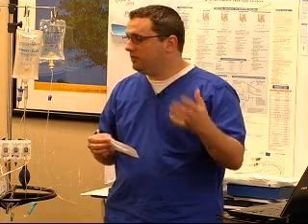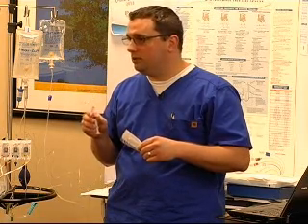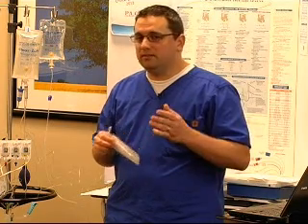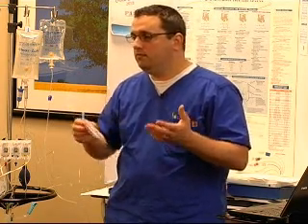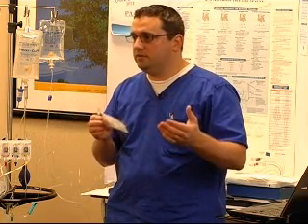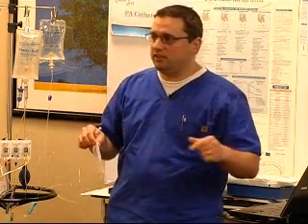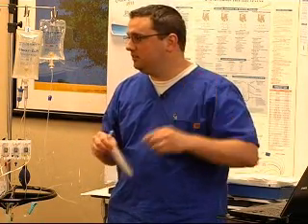Well, that's not the farthest we can reach. A true SVO2 is sampled out of the PA port, which is the best sample we could get. Okay, but there's about, literature says anywhere from 7 to 8% of loss of oxygen from the time you would get an SCVO2 back all the way into the heart, around and up and across to where you would draw it out of the PA distal port.